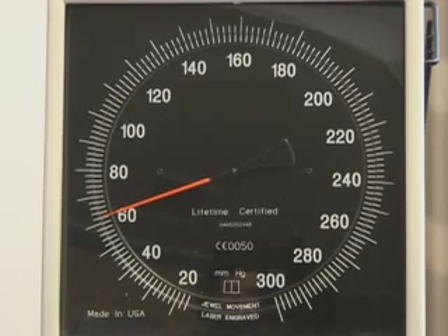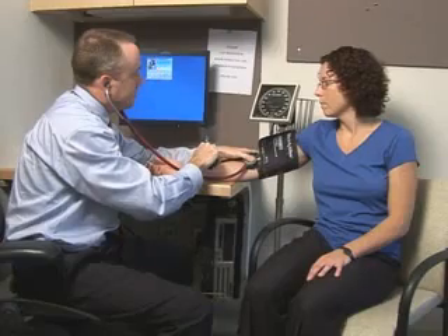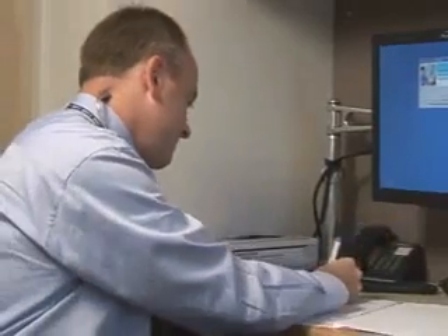To ensure that diastole has been reached, the cuff pressure should continue to be deflated for an additional 10 mmHg beyond the 5th Korotkoff sound. You should measure the blood pressure twice at a minimum, waiting at least one minute between readings. The average of the measurements should be recorded.